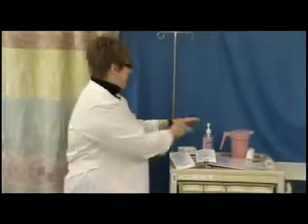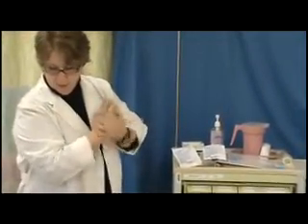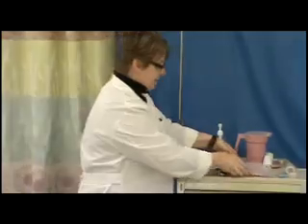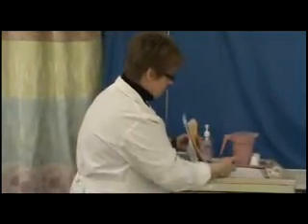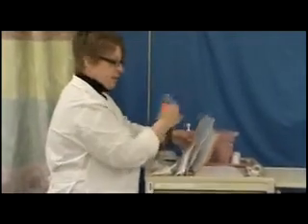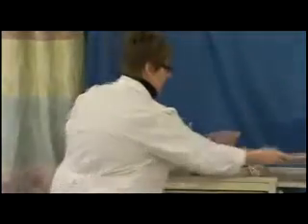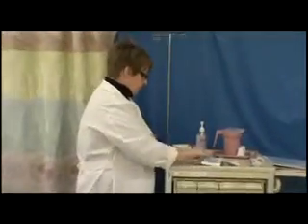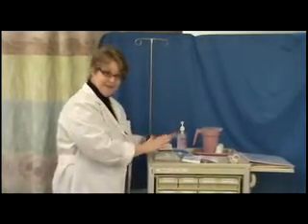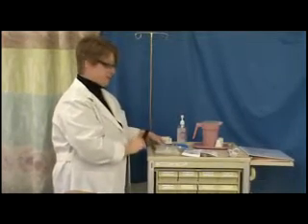So we perform our hand hygiene, and we, of course, prepare our medication for one patient at a time. We compare, just as always, our MAR to our solution, and we select the right one. We compare our MAR to our second solution, and we get the right one. Then we can set the MAR away, actually we can't set it away, sorry. We have to do our second and third checks. But for the purposes of this, as I said before, I'm just showing you the mechanics of what you have to do with the tubings and the solutions.